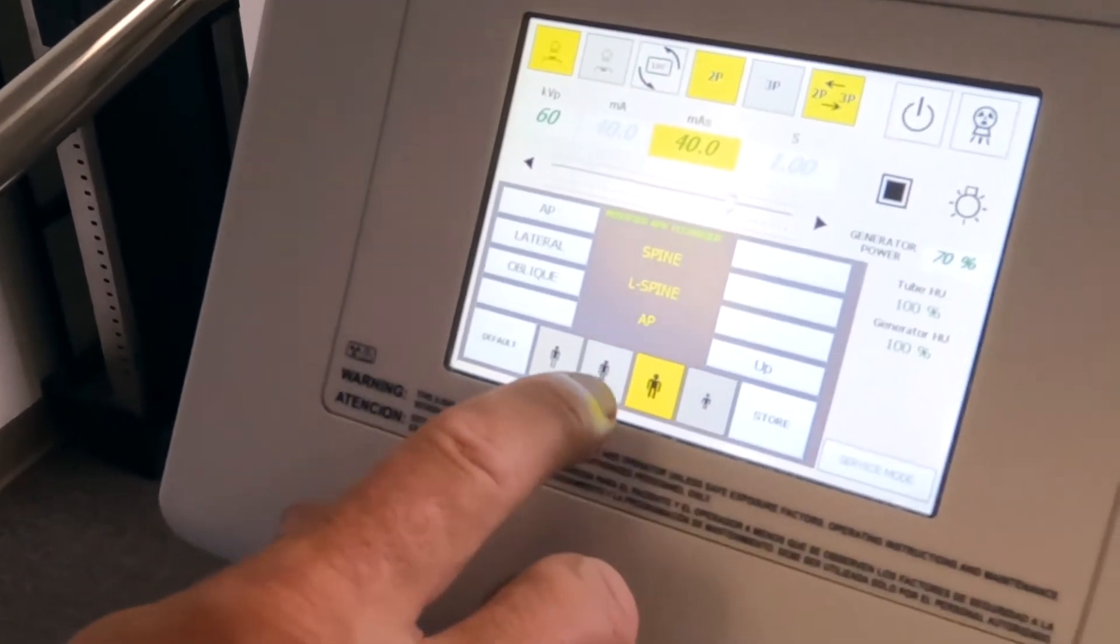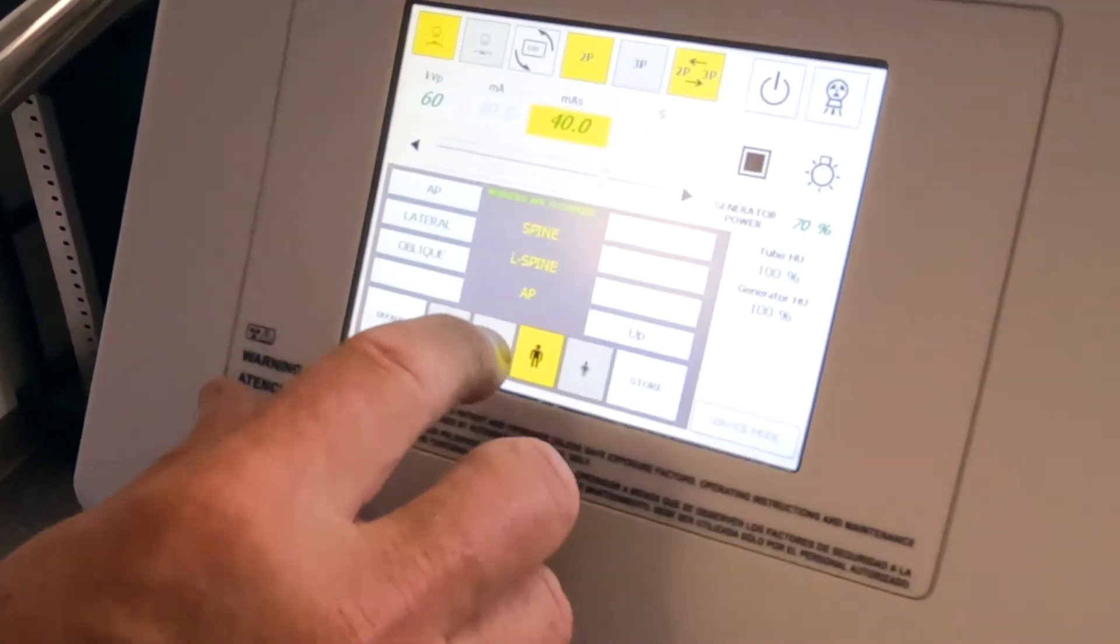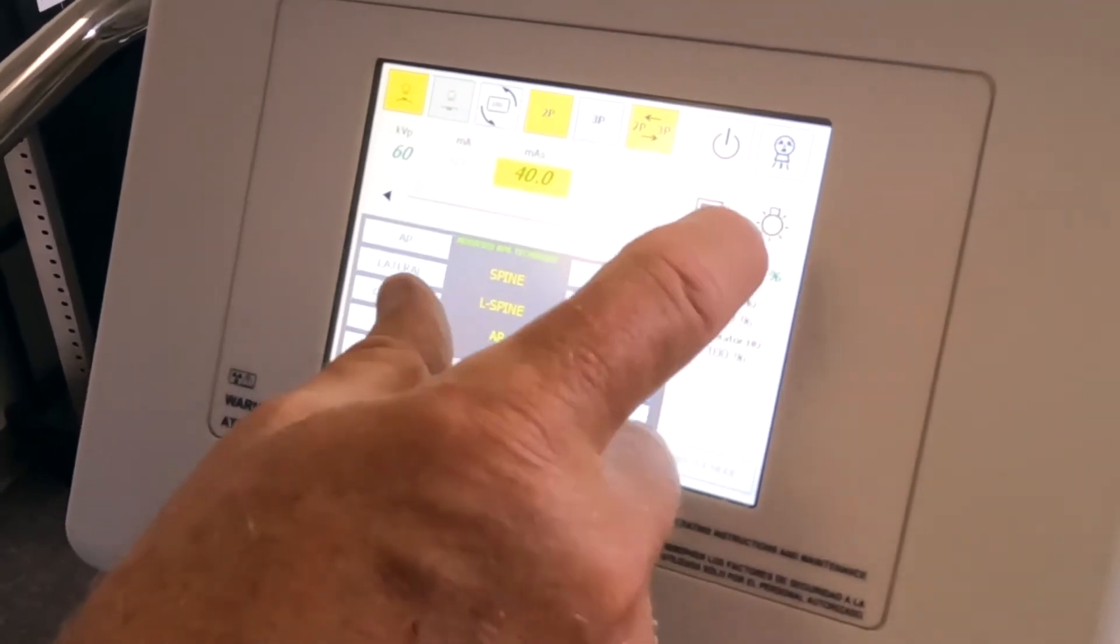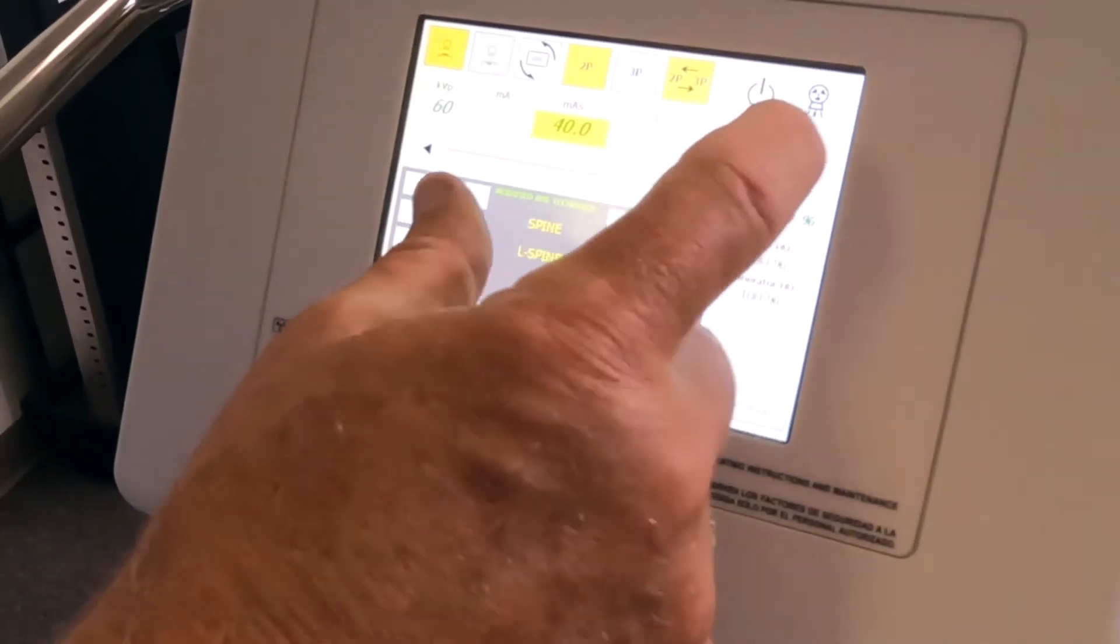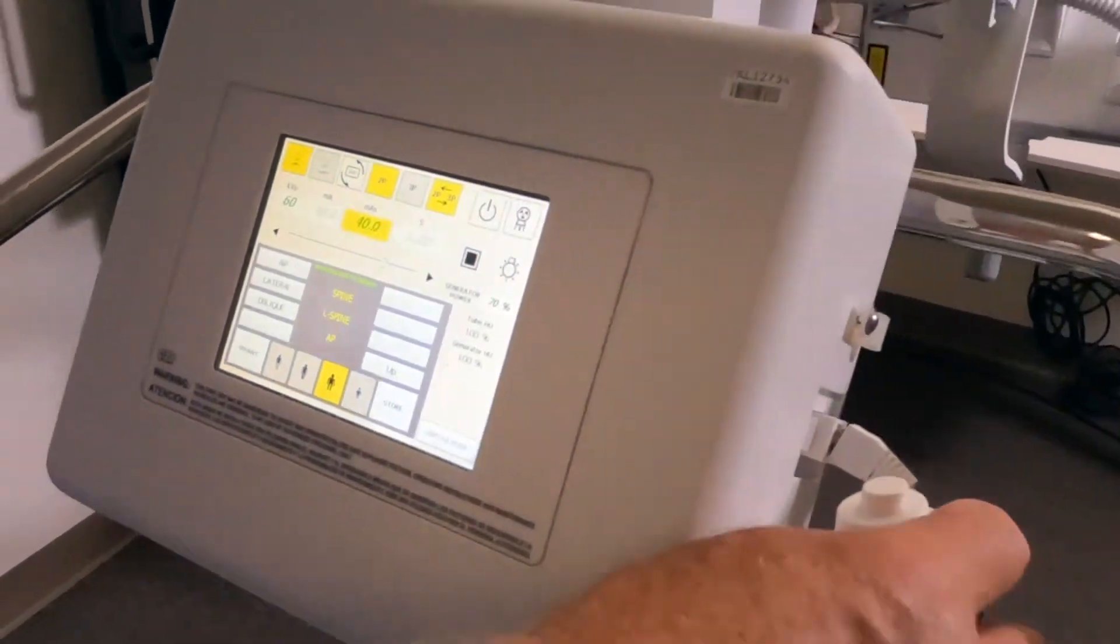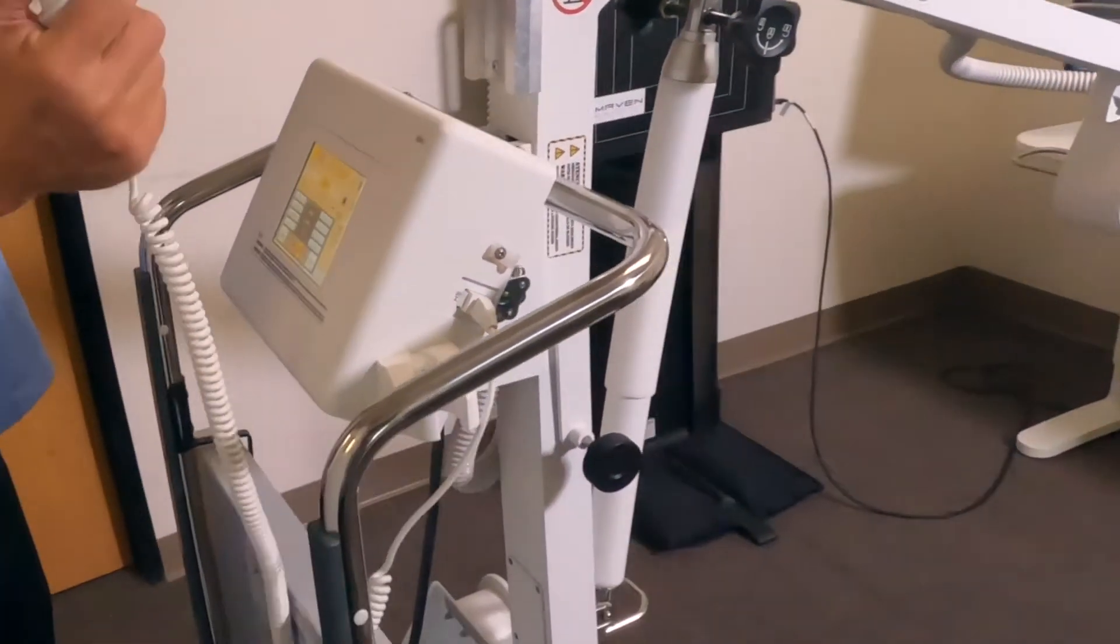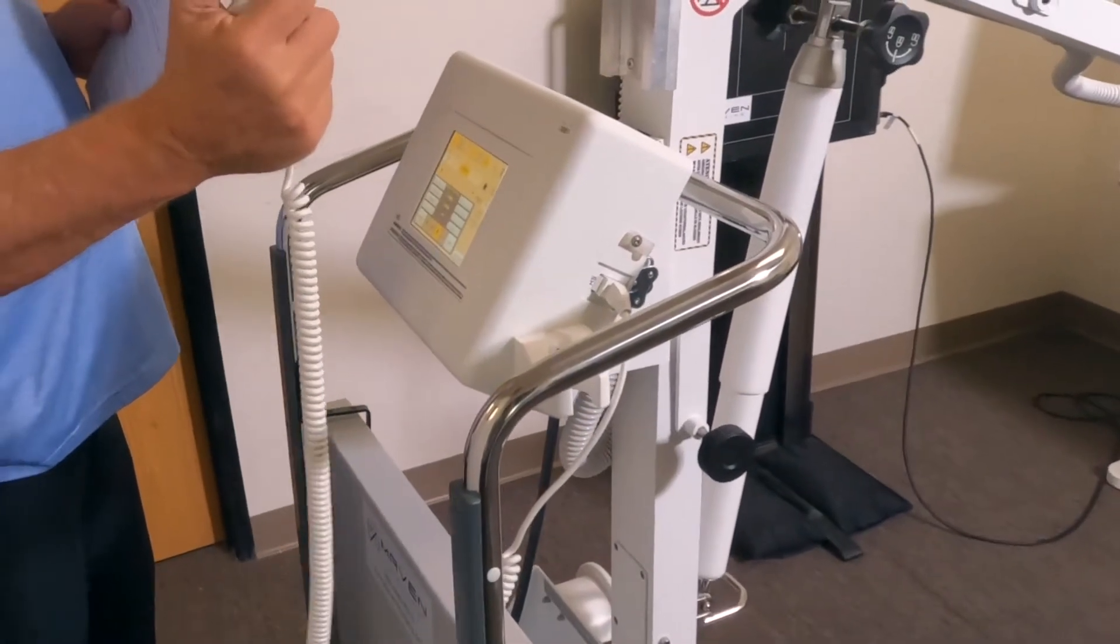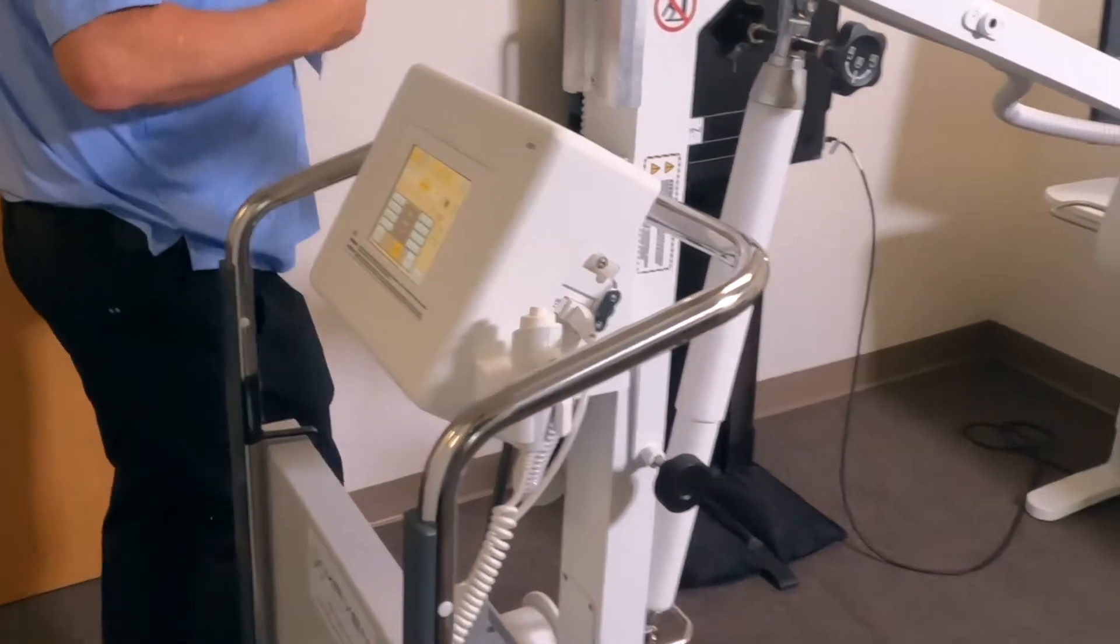Then we set the large focal point. We've clicked on that—that's the small, this is the large. Then what we do is press the trigger button until you hear the beep.